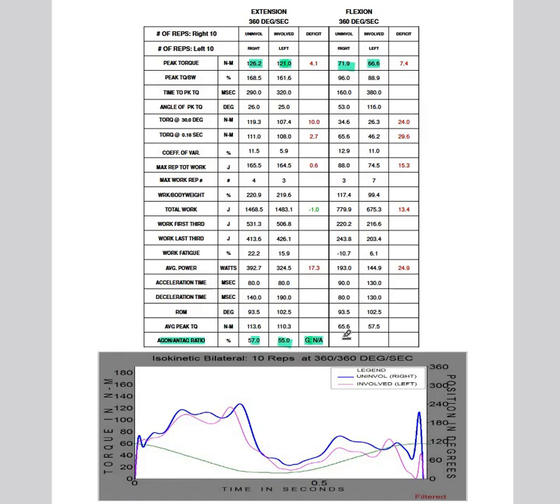You have them across a range of different angular velocities, for athletic and non-athletic populations, and you can easily find this information online. You might find that there are some differences in more recent literature with more specific sample populations, but as long as you've got something to compare them to. So the hamstring quadriceps ratio that we've performed here is a concentric ratio.